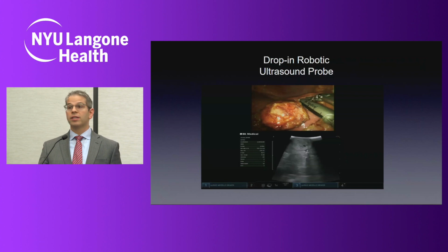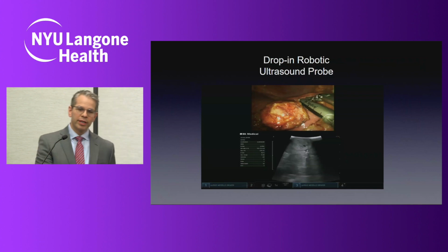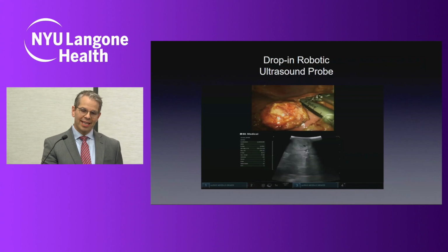The surgeon is not lifting his head up. He's not leaving the console. He's not distracting from the surgery. He can control multiple instruments at the same time, or she. And what we can do is we can take a look inside the kidney and determine how deep this tumor is. We can take a look and see if it's closer to any of the arteries than it should be, or if there is any blood vessels or collecting system or anything that is going to affect our surgery or our ability to control the cancer, because ultimately these surgeries are done for cancer control, the vast majority of them.